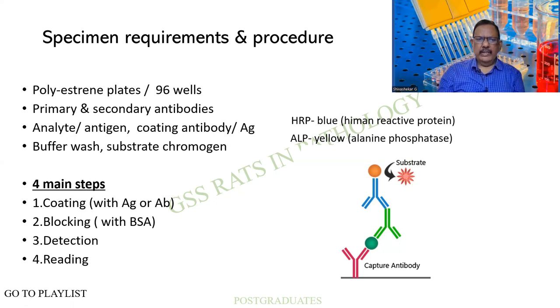So what will happen is the antibody and the antigen are being coupled together, and they are being washed with a buffer. If it is an adherent substance, it will remain, whereas all the non-specific ones are getting washed off. These are later on measured or identified by means of a substrate or a chromogen.